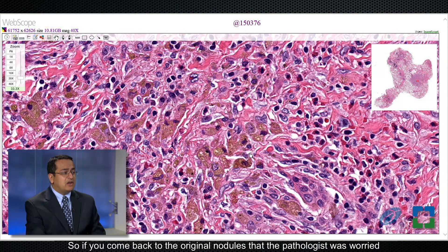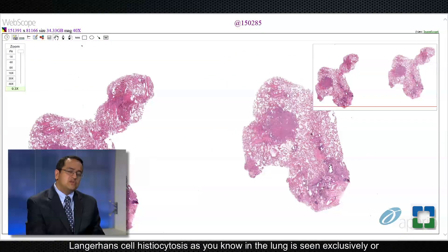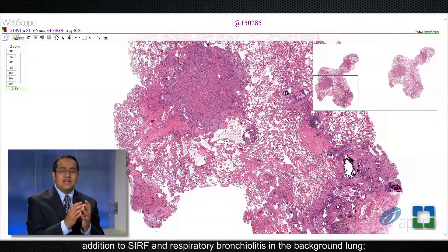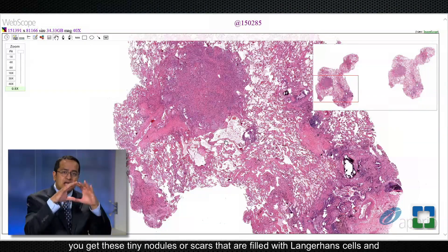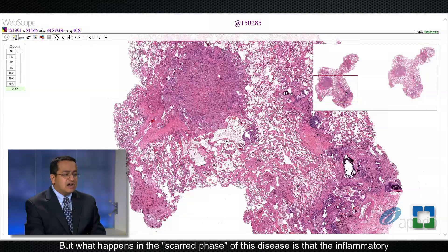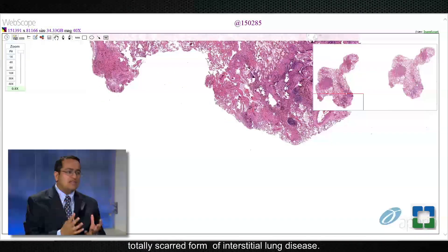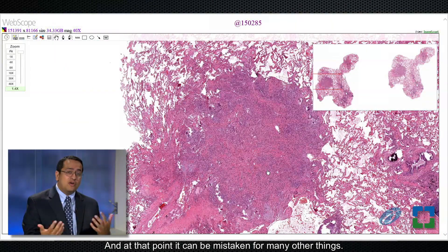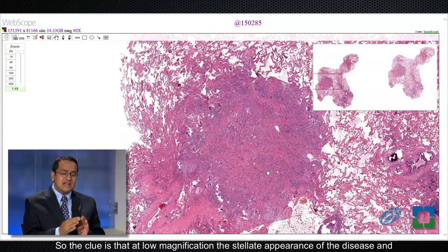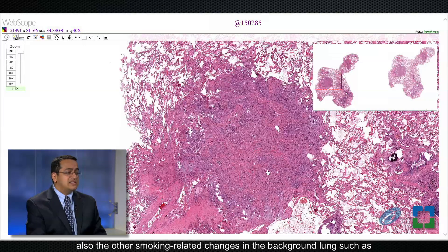Coming back to the original nodule that the pathologist was worried about — this is actually the scarred phase of Langerhans cell histiocytosis. In the lung, Langerhans cell histiocytosis is seen exclusively or nearly exclusively in cigarette smokers, and in these patients you get nodular lesions in addition to SRIF and respiratory bronchiolitis. In the scarred phase of this disease, the inflammatory cells start to go away, the Langerhans cells disappear, and it becomes a totally scarred form of interstitial lung disease. At that point it can be mistaken for simple scars or even usual interstitial pneumonia. The clues are the stellate low-magnification appearance and the smoking-related changes such as SRIF in the background lung.